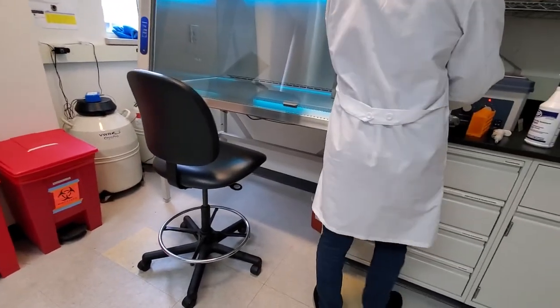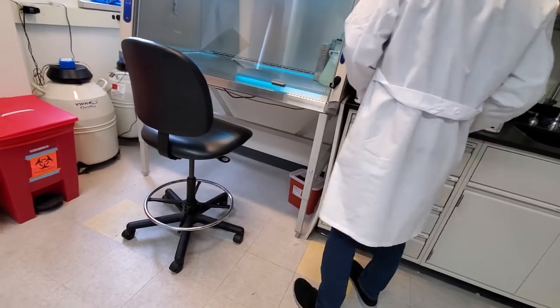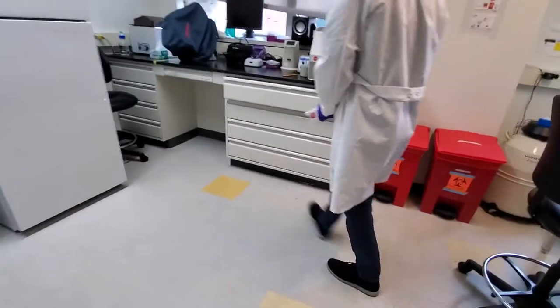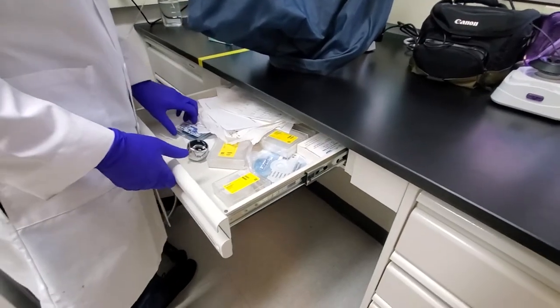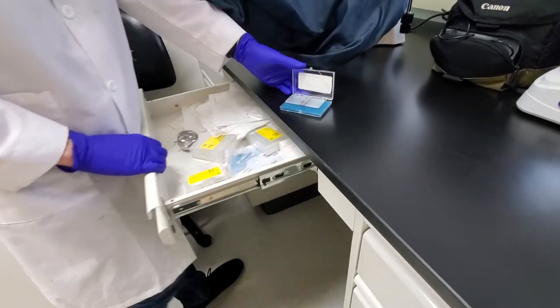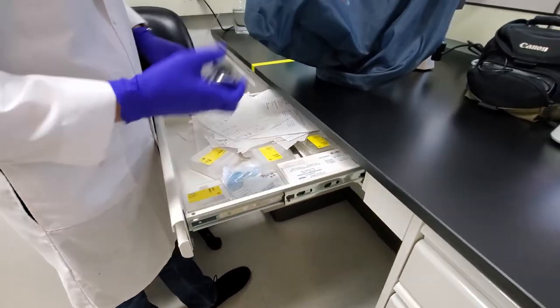Can I take a look at your hemocytometer really quickly, too? Sure. We don't need to use it today, obviously, but just so I know where it is. Let me just put this stuff away. Like the traditional hemocytometer here, little slide. If you need more slides, I pull my cover slips for the glass right here. If you want to, I like to use this little counter here.